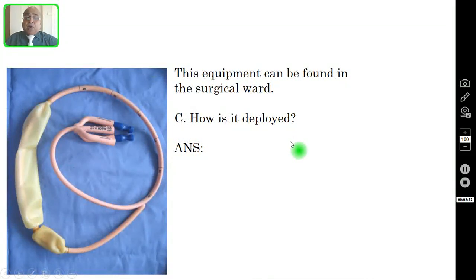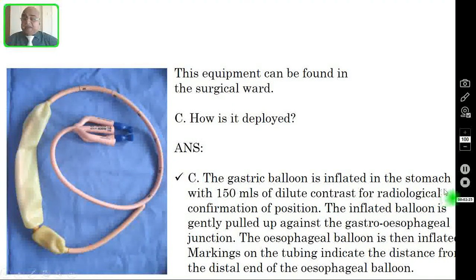Question number three: How is it deployed? The gastric balloon is inflated in the stomach with 150 ml of dilute contrast for radiological confirmation of the position. This is the gastric balloon and this is the esophageal balloon. After inflating the gastric balloon with 150 ml of dilute contrast, this inflated balloon is gently pulled up against the gastroesophageal junction. The esophageal balloon is then inflated. The markings on the tubing indicate the distance from the distal end of the esophageal balloon.